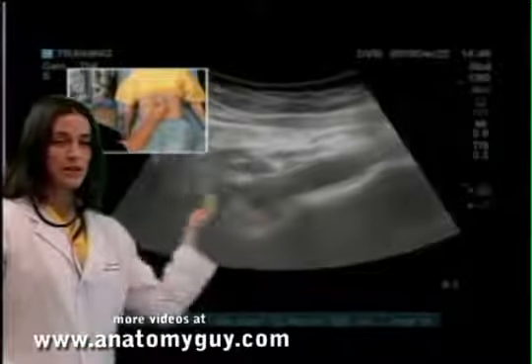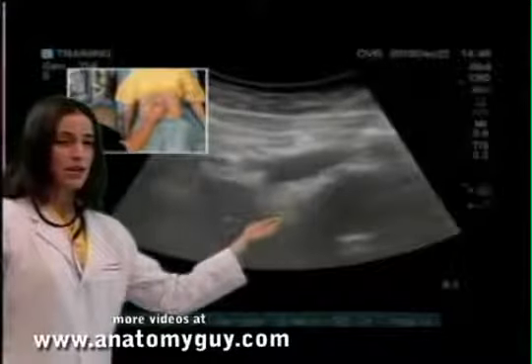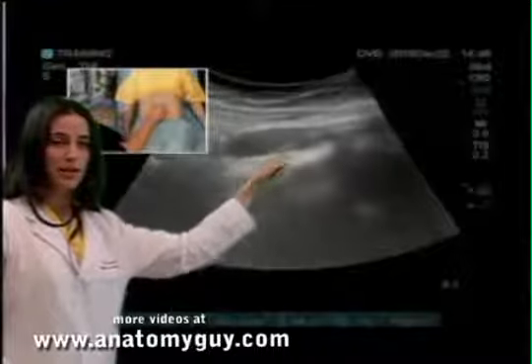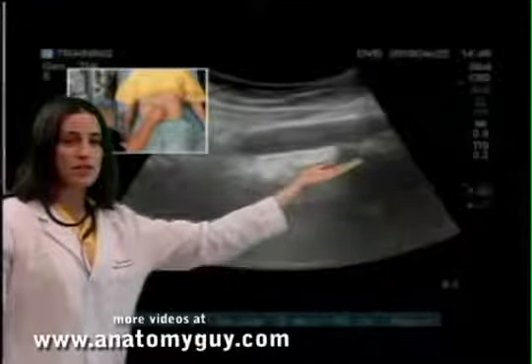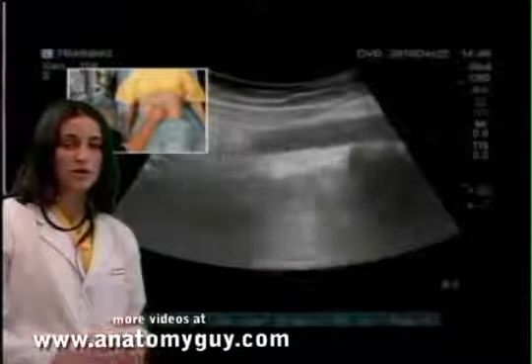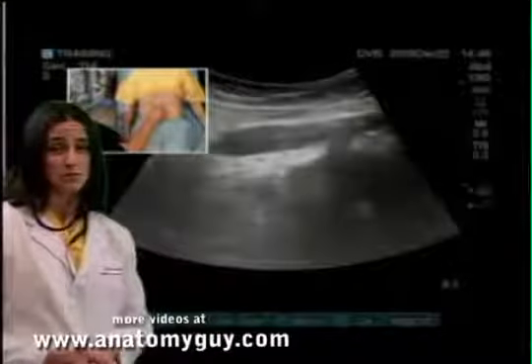We see that the SMA and celiac have just come off. We're scanning down and moving the probe downward towards the patient's feet. We see the two parallel lines in the black hypoechoic region indicating that there's blood. This is the abdominal aorta, and we scan down towards the feet and the bifurcation of the common iliacs. It's uniform throughout its length, and scanning back up, it maintains its uniformity, indicating that there is no aneurysm.